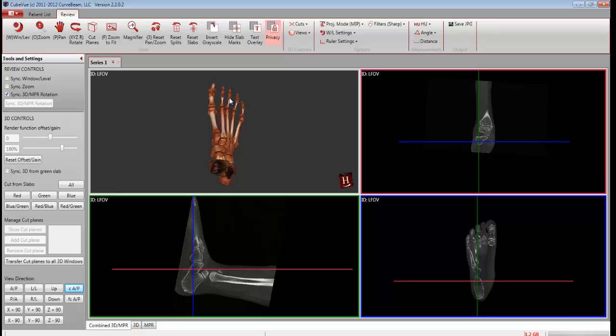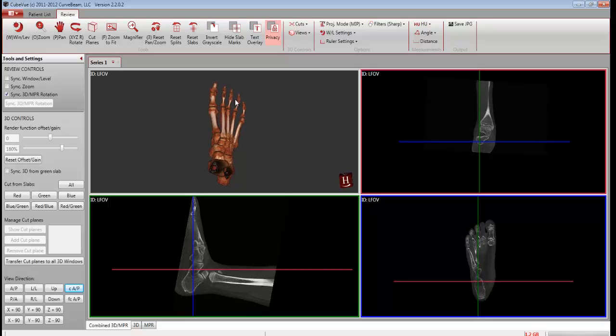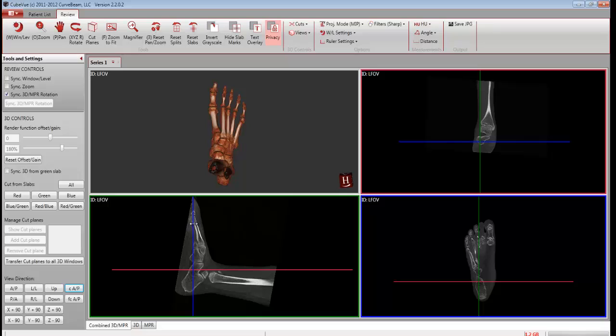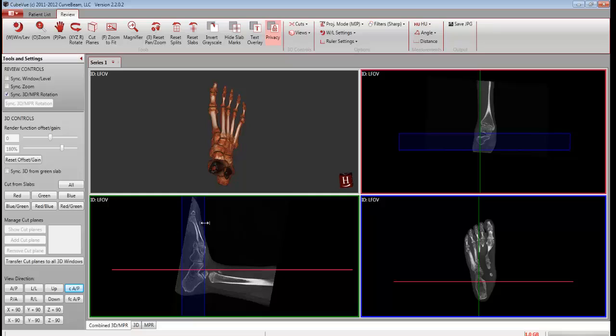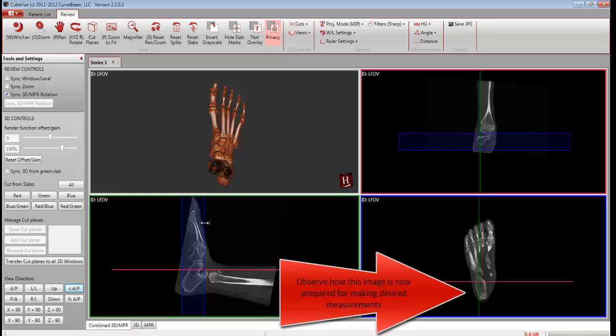Next, increase the slab thickness to encompass the height of the metatarsals. Do this by holding down the Shift key and double clicking. This will enable the cursor for slab thickness adjustment. Once the cursor is enabled, drag the blue line to your right to expand the slab.